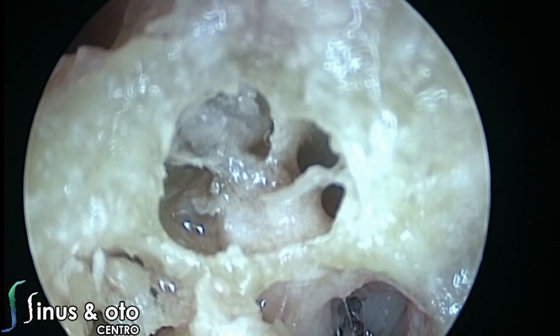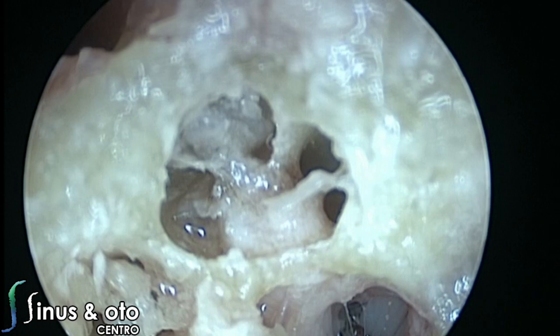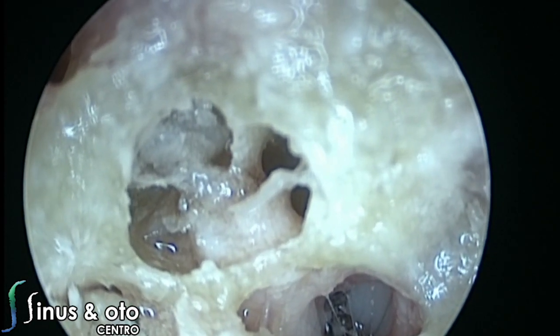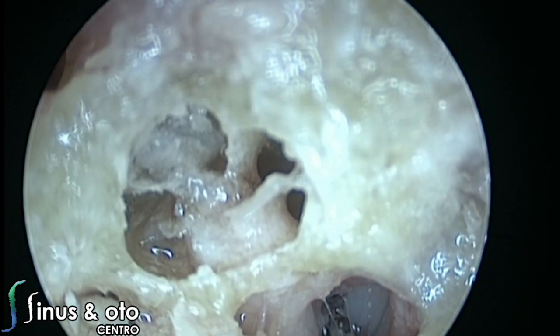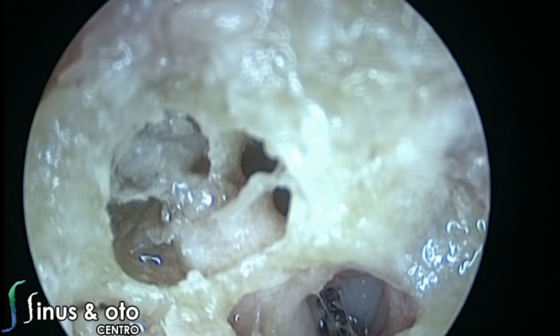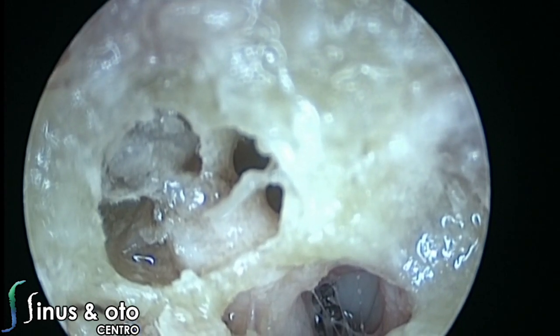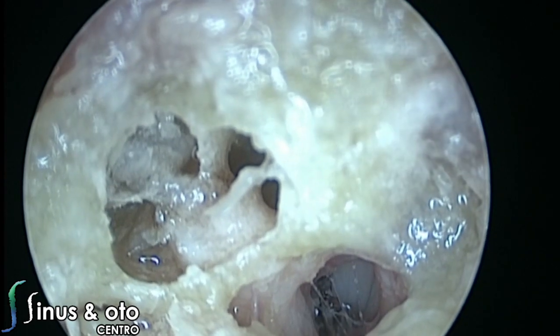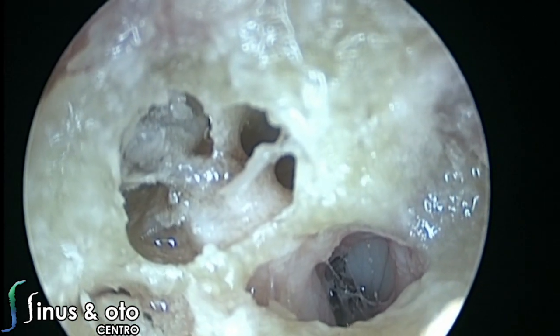This can be a less invasive approach when compared to other traditional approaches using other instruments. So it's a very nice way. Or even if you don't want to do lateral skull base or inner ear approaches, you can understand the anatomy in order to see what is beyond the middle ear in this endoscopic view.